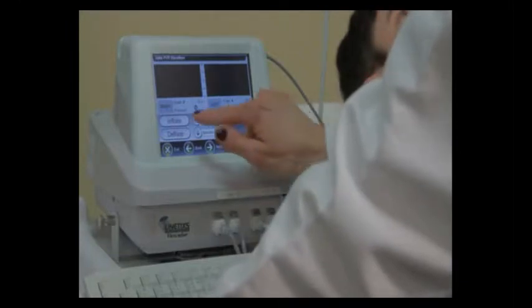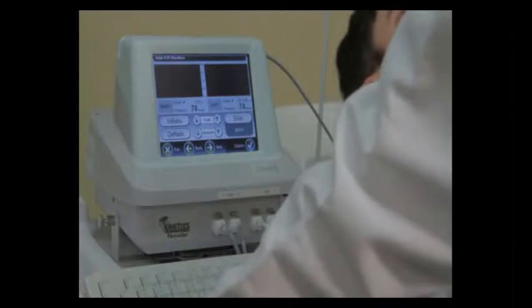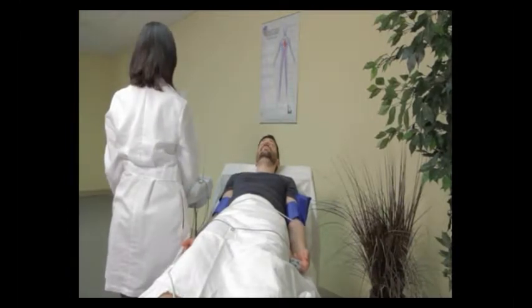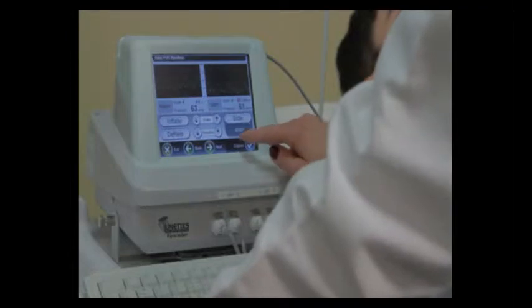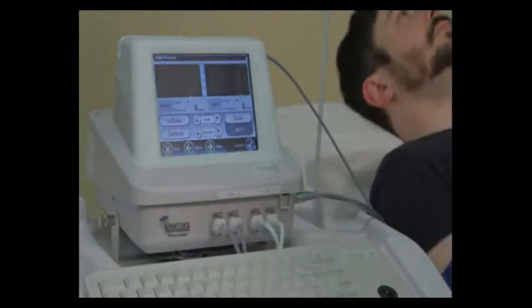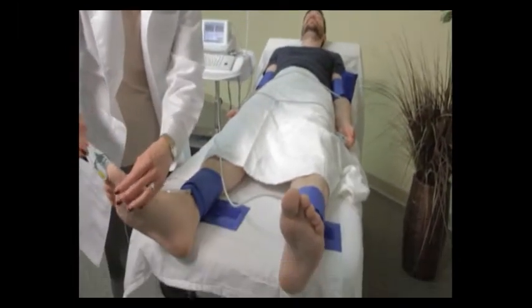She's now going to press inflate to inflate the ankle hoses for the pulse volume recording waveform at the ankle level. With one touch, the REVO will inflate both cuffs to 65 millimeters of mercury pressure. We now see the waveforms are consistent so we're going to press capture. We're then going to press proceed and then move the PPG clips from the fingers to the great toe on the left and right foot.